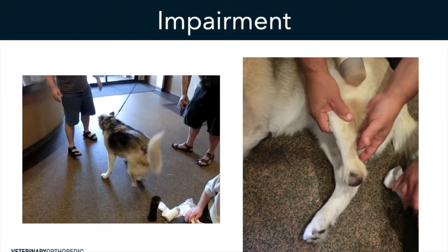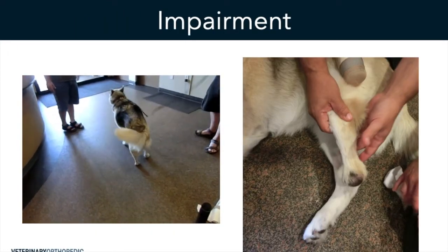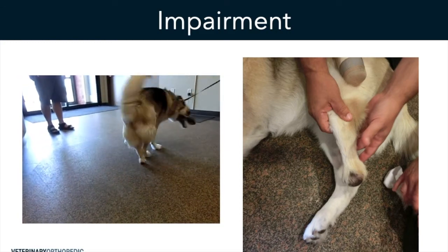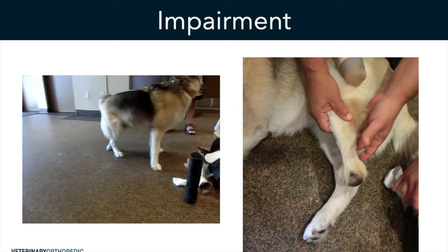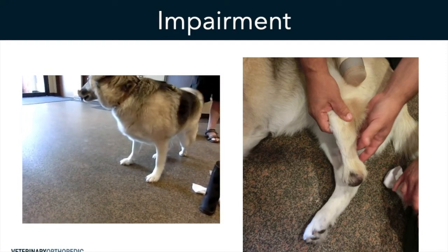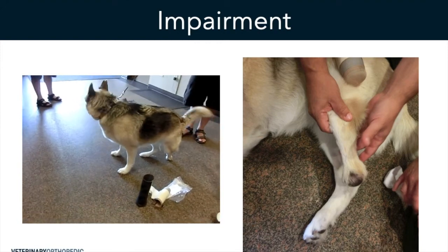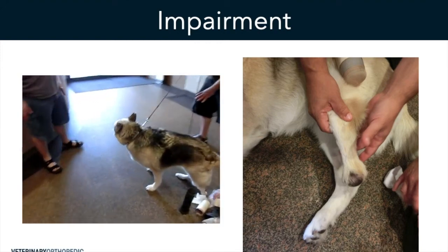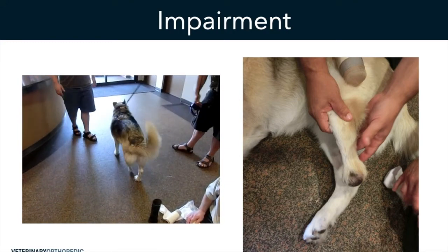So now this is a suction. You see how collapsed her other hock is. Oh, wow. Can I just give you just a little walk down there? It's hard for me to put her exactly where you want her. You can see how collapsed her other hock is.